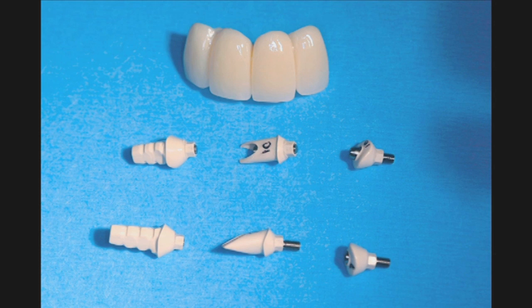The laboratory also pre-surgically fabricated a biotemp bridge, number 7 through 10, from lateral incisor to lateral incisor. All are the approximate ideal tissue contour and emergence profile that were determined using our computer software.